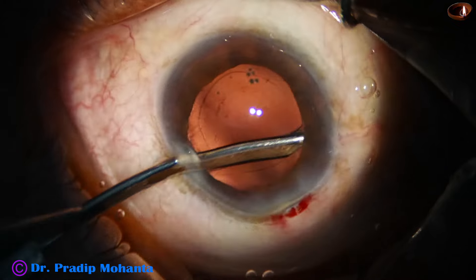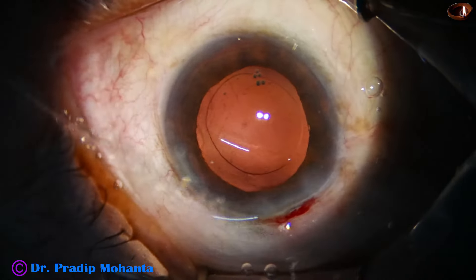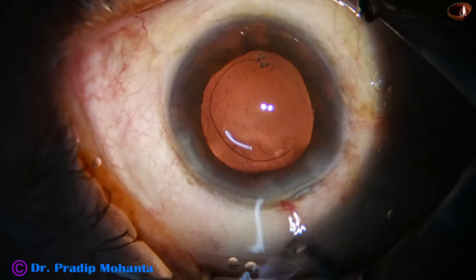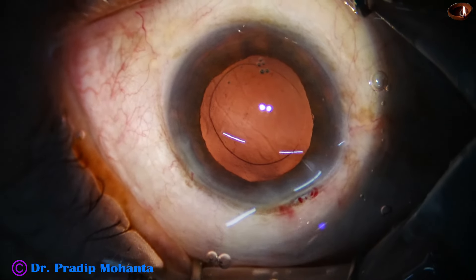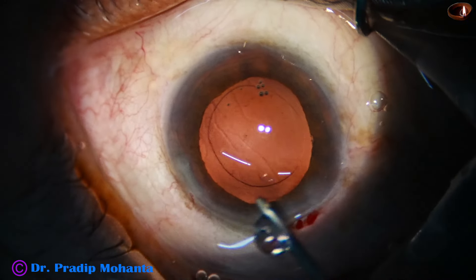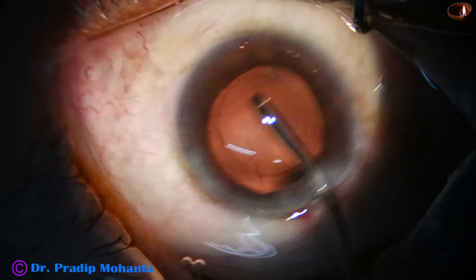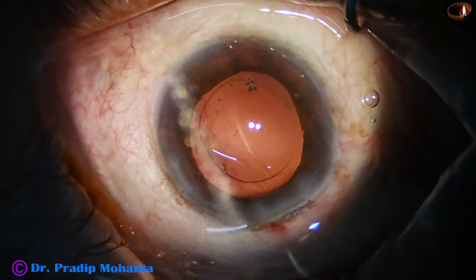The cortical matter is nicely removed and now it is time to implant an intraocular lens. I take the irrigation probe of a bimanual irrigation-aspiration set and by the irrigation itself I can polish the posterior capsule — you can call it irrigation polish.